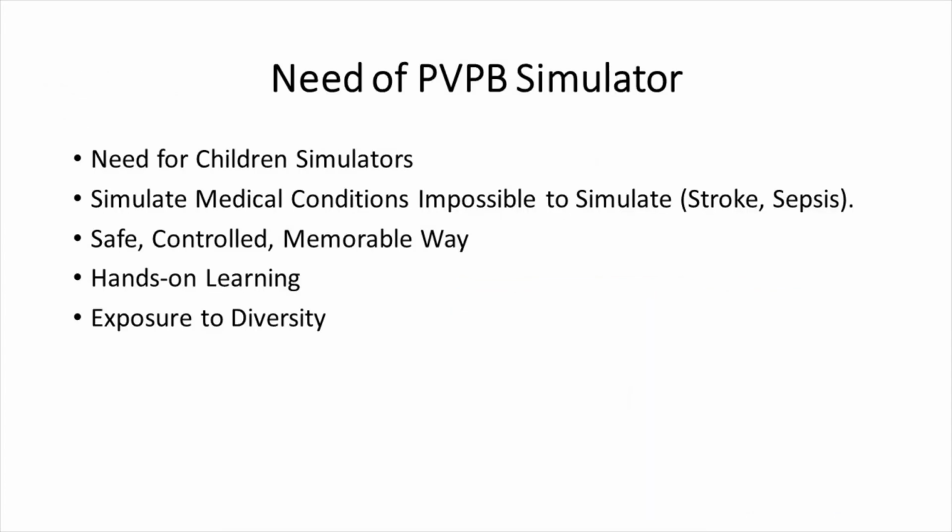A simulator like the physical virtual patient bed is needed to simulate medical conditions impossible to simulate in a safe, controlled, and memorable way, such as stroke or sepsis. It provides hands-on learning, especially for children patients, as it is impossible to recruit children as actors. It also provides a diversity of patients and scenarios.